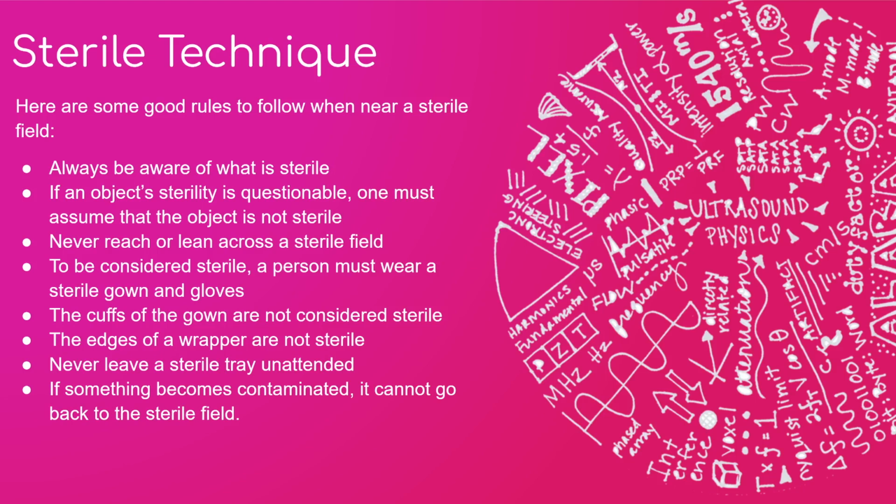Even though it's important, once you have a sterile field set up, don't leave it alone. A lot of people are tempted to set everything up and then walk away from it. You really do need to stay with that sterile field to ensure that it stayed in the sterile position and that nobody came in and touched a bunch of things.